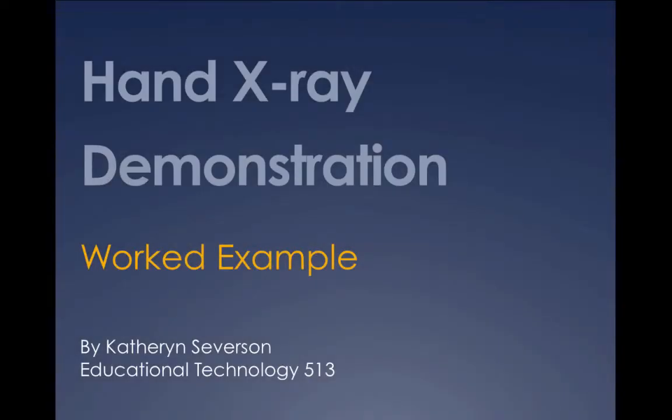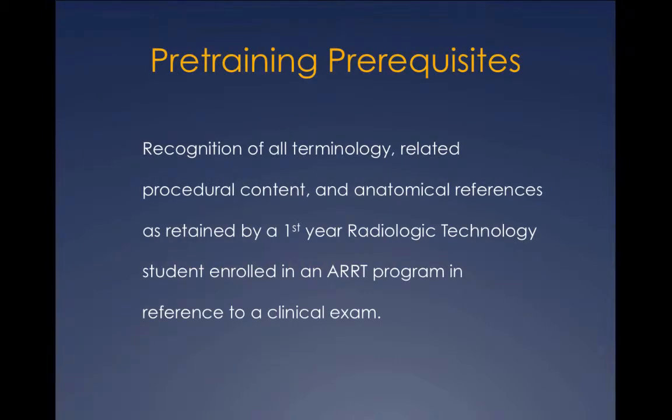The following is a worked example of a hand x-ray demonstration by Catherine Severson at Tech513. The following paragraph contains the pre-training prerequisites necessary before continuing on with this demonstration. Read the paragraph, and if you feel as if the prerequisites have been satisfied, continue on.